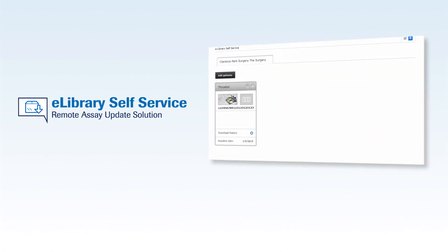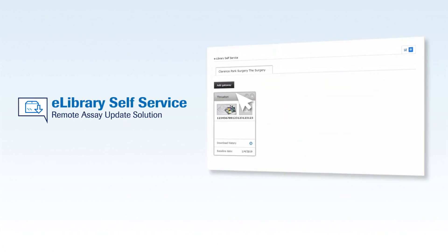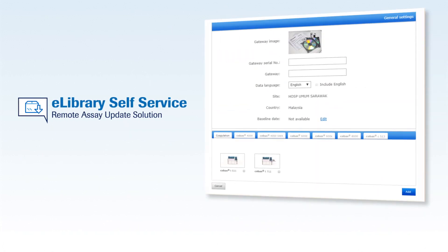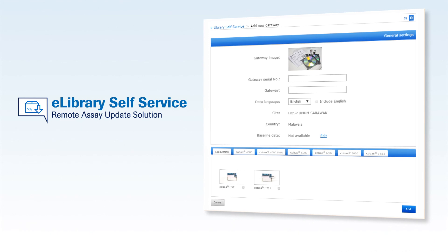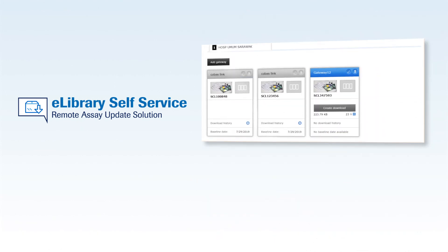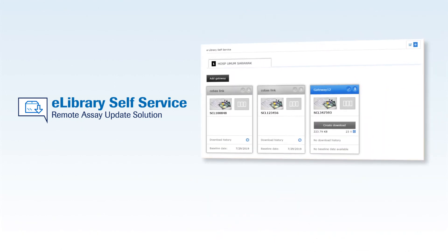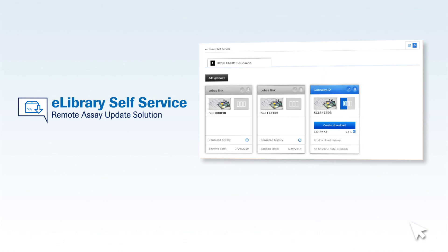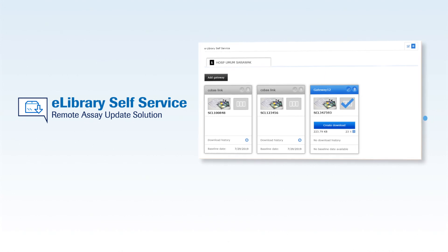The eLibrary self-service helps you to keep Roche region information up to date when internet connection is not available. No need to wait for Roche personnel to deliver the CDs to you, and less waiting time for updates.